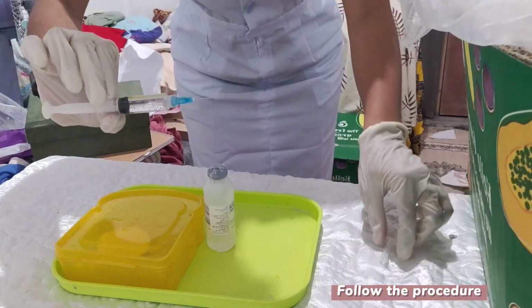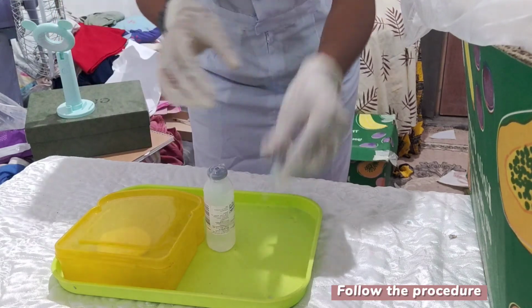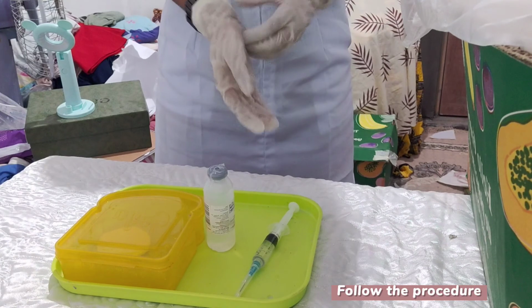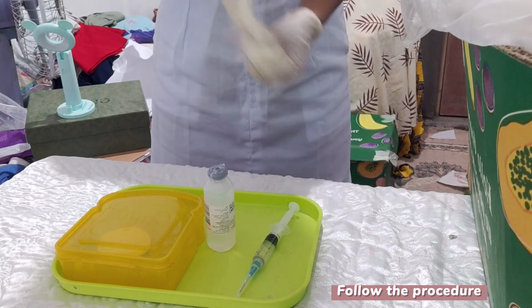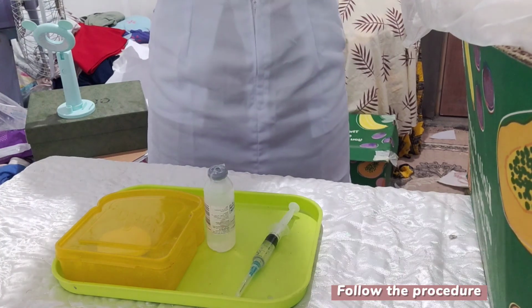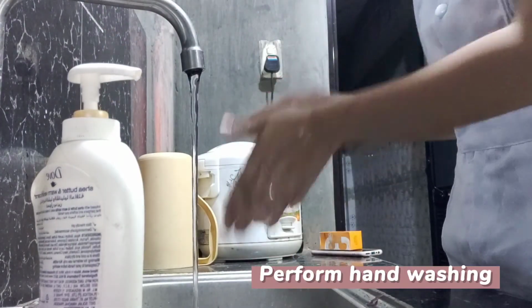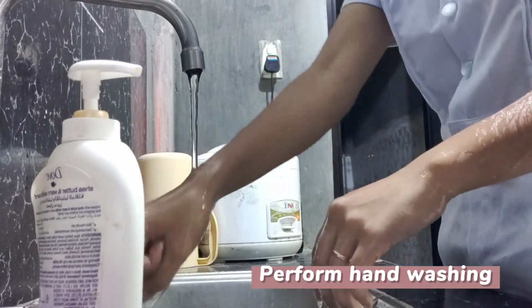Now we will cap the needle. Okay, so now we are done. Now I am going to remove the gloves and do the hand washing. We will administer the medication depending on the physician's order.